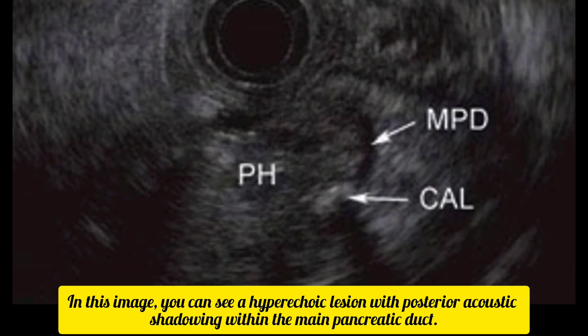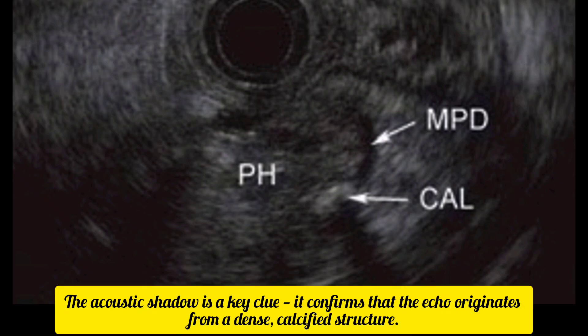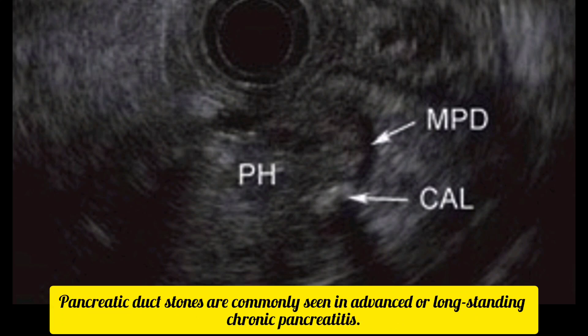In this image, you can see a hyperechoic lesion with posterior acoustic shadowing within the main pancreatic duct. This is a calcified pancreatic stone. The acoustic shadow is a key clue — it confirms that the echo originates from a dense, calcified structure. Pancreatic duct stones are commonly seen in advanced or long-standing chronic pancreatitis.